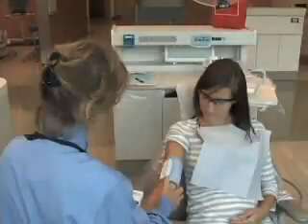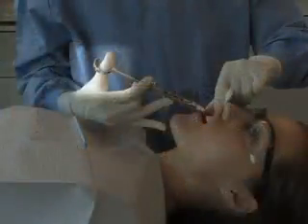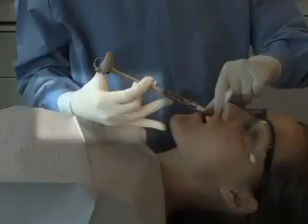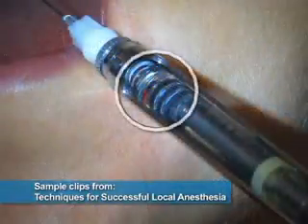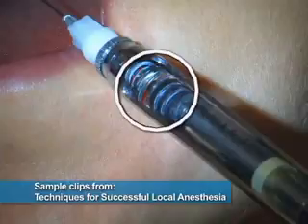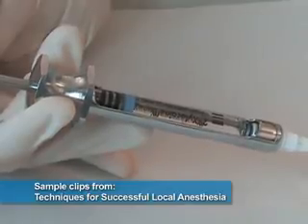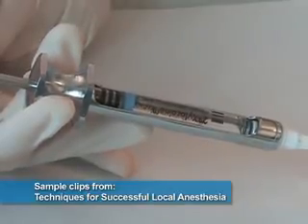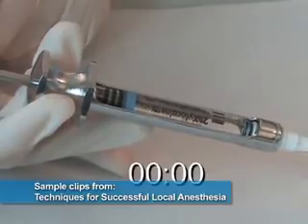The first unit discusses basic injection techniques that should be utilized when administering any type of local anesthesia injection. If aspiration is positive, assess the amount of blood that has entered the cartridge. If there is just a small trickle, re-aspirate, and if negative the second time, continue with depositing. Remember that the anesthetic cannot be deposited any faster than 1 minute per carpule. Here is an example of an appropriate deposition rate.